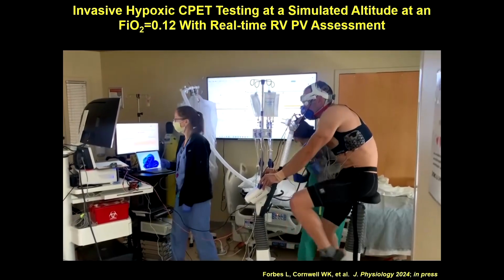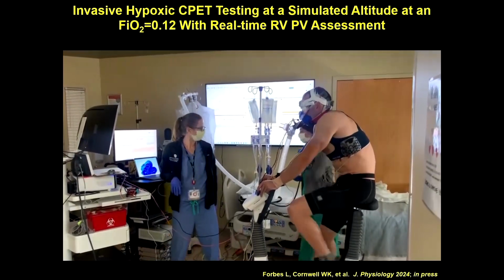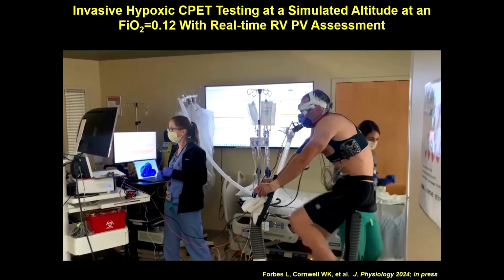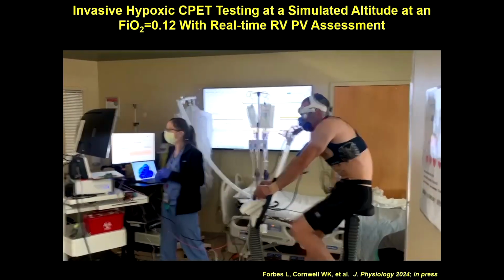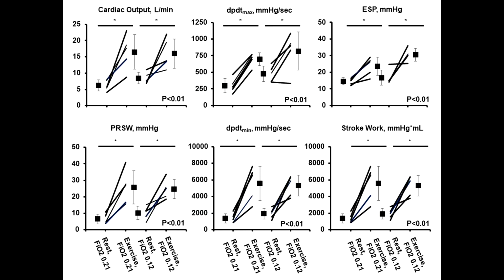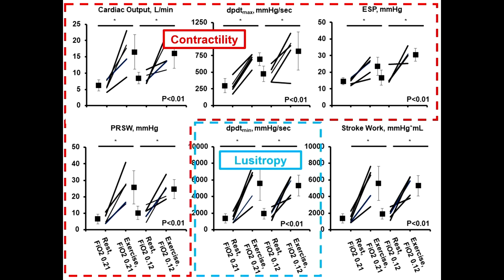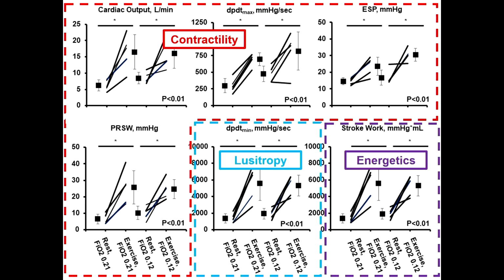Our group, we tried to better understand this a couple years ago. This is an example of an invasive hypoxic CPET where the individual is breathing hypoxic gas from Douglas bags, simulating an altitude well over 14,000 feet. And just painting with broad strokes here, again, when we think about pressure volume analysis, we can look at things like contractility, lusitropy, myocardial energetics. And just as a reminder, I told you the original findings from that Operation Everest 2 trial were that the right atrial pressure is normal, so RV function is unaffected by hypoxia.